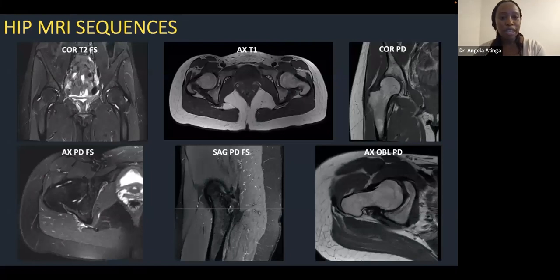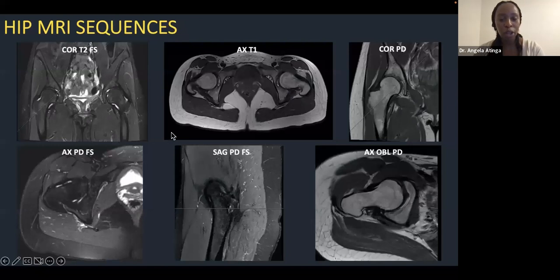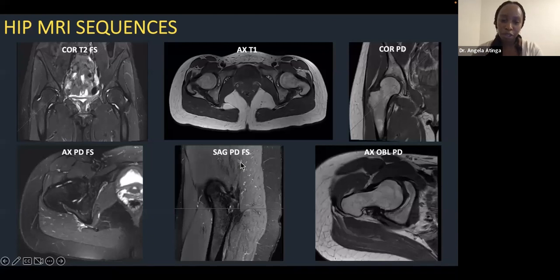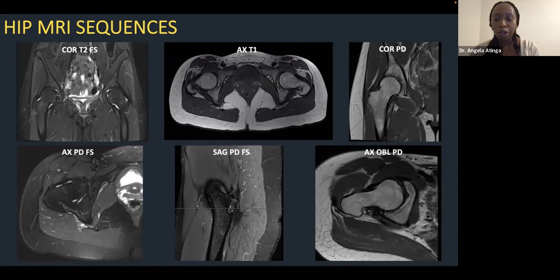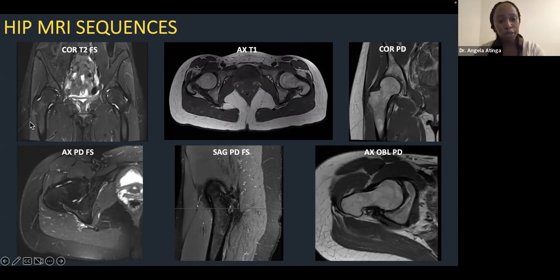Looking at a routine MRI sequence, most institutions will have a variation on this theme. At Sunnybrook we have a large field-of-view coronal T2 fat-sat image to see the whole pelvis, and a similar axial T1 non-fat-sat image. We then have three-planar small field-of-view images of the hip of interest. The axial PD images are axial to the pelvis, not to the femoral neck. When the surgeon is interested in the labrum or a CAM lesion, we acquire an axial oblique sequence — oblique along the full length of the femoral neck, so axial to the femoral neck but oblique to the pelvis.